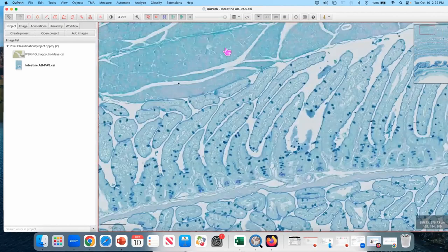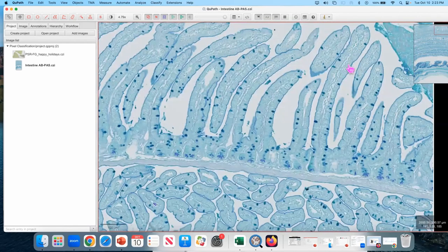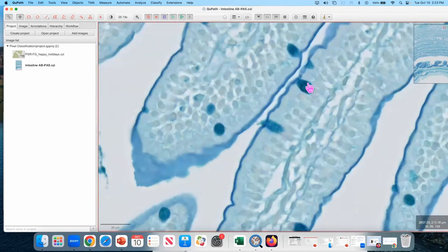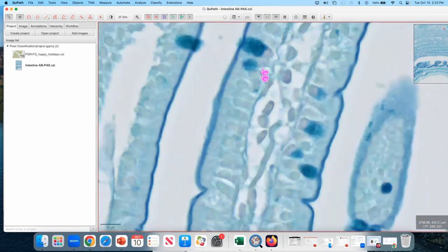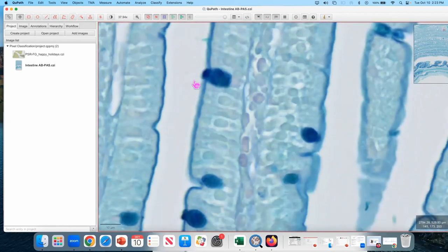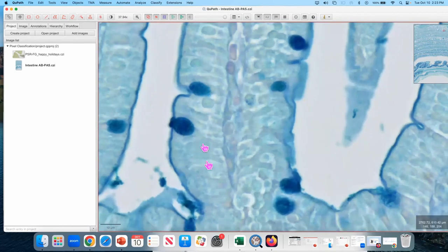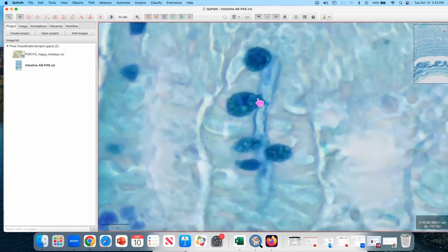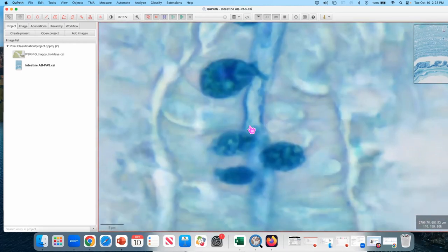intestine, over here we have some pancreas, and it's another Swiss roll where we have these tall and slender villi, and in villi, we have those goblet cells that we've seen on day one, and they are very nicely stained. This time they're stained very, very intensely. You can see where the name's coming from. They look like little goblets. They produce a lot of mucus. You can sometimes catch them in the process of disposing of this mucus or throwing it into the lumen of the crypt.